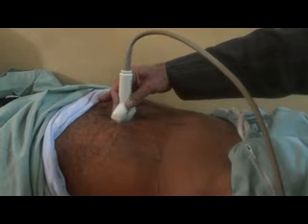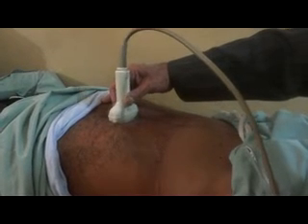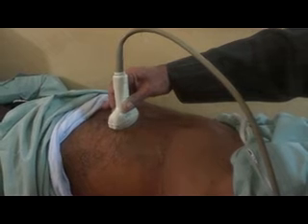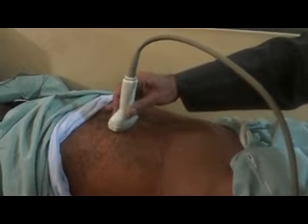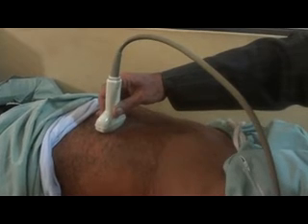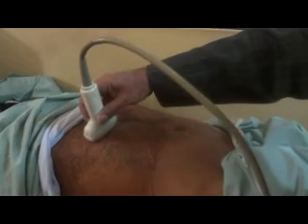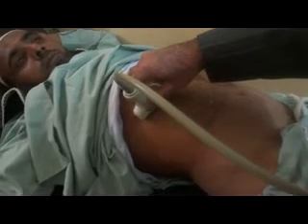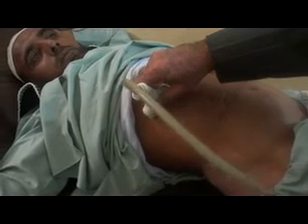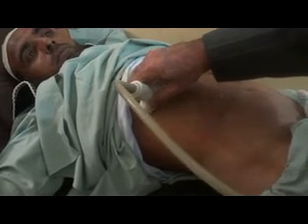We are seeing this in a patient in supine posture. In this area, otherwise you could say these are anechoic areas seen within the portal vein — but these are not just anechoic areas. This is recanalization: you see small tiny vessels, and then these tubular vessels. So this is the cavernous transformation of the portal vein — recanalization of the portal vein.